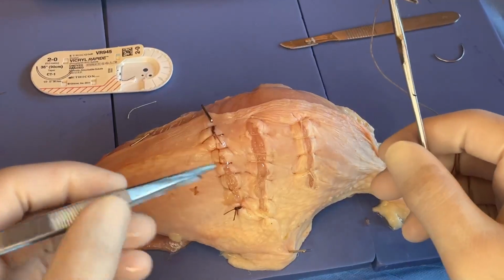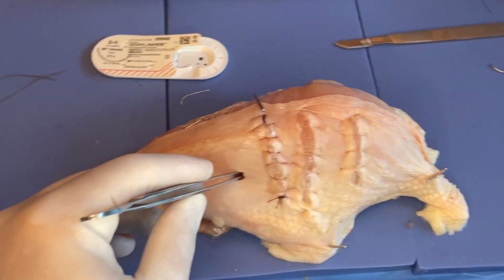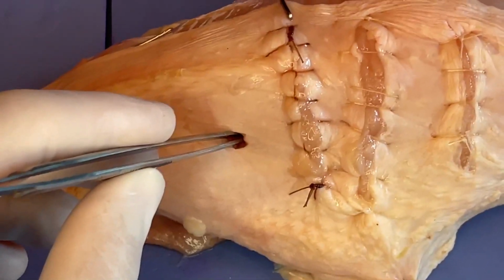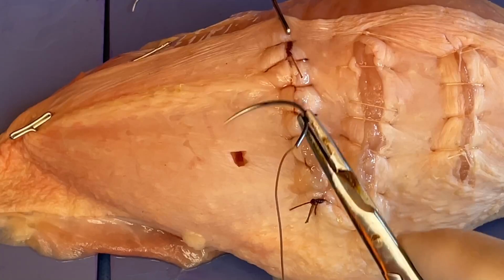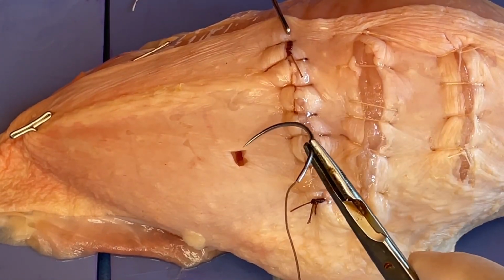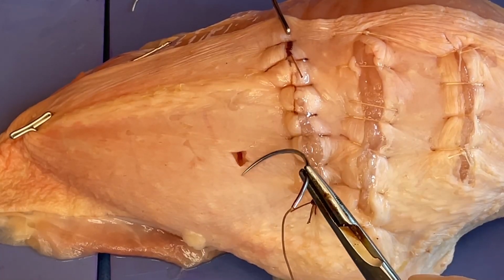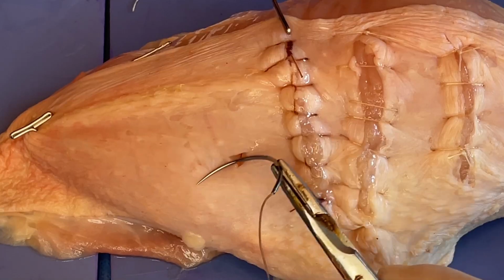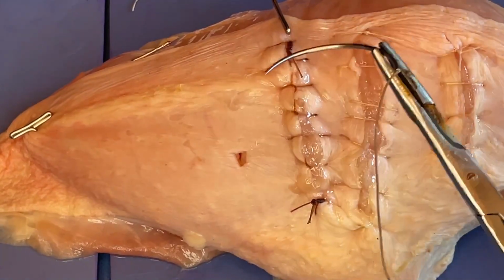What we've got here, I created a small defect here, and we're going to say that that's our area of bleeding. Let's just get a little bit more zoomed in on that. So, one area of bleeding, we don't really need to do a running suture because we don't have a length of defect that we're closing. To do an interrupted, we could try to do a single interrupted across that, but if there are blood vessels coming in making this little area bleed, doing a single interrupted and tightening across this line, or really any single line of pressure, might not do the job.